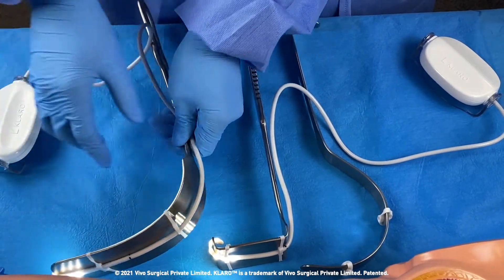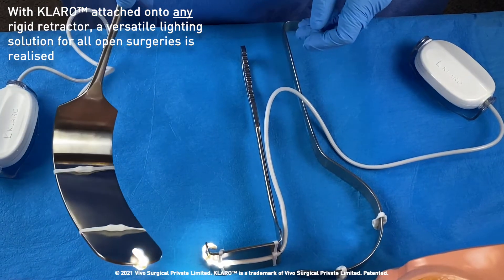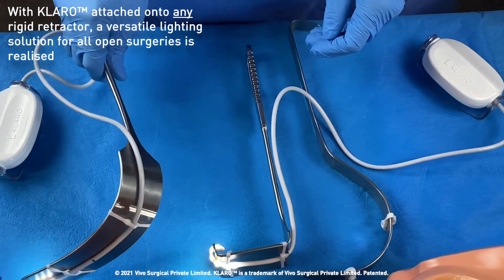Now with KLARO's retractor loops, KLARO can be easily fitted onto any type of rigid surgical retractor, creating a versatile lighting solution for all open surgeries.